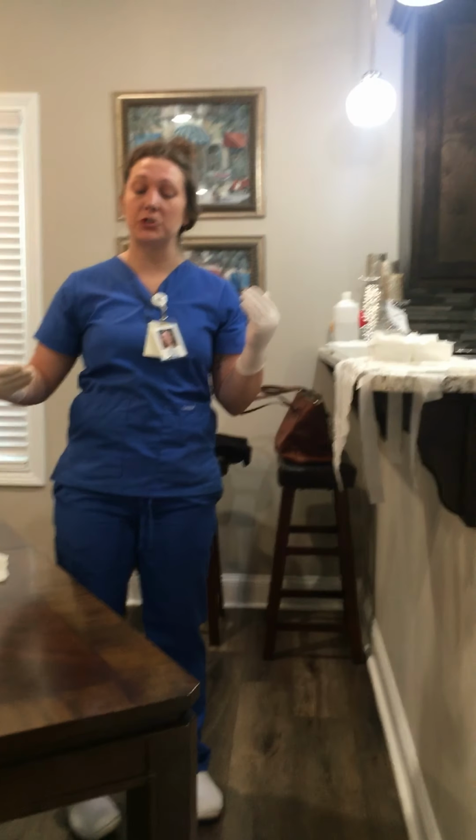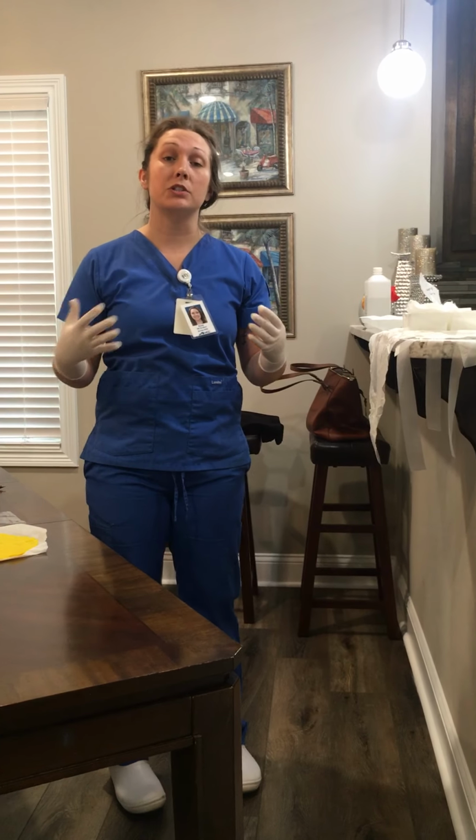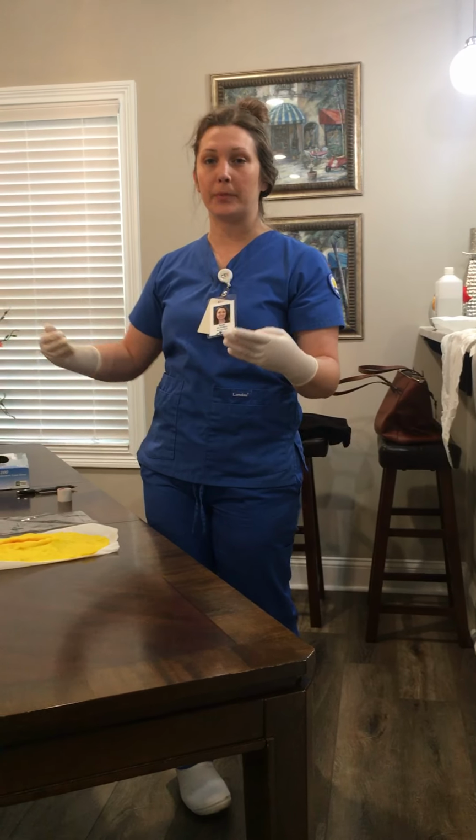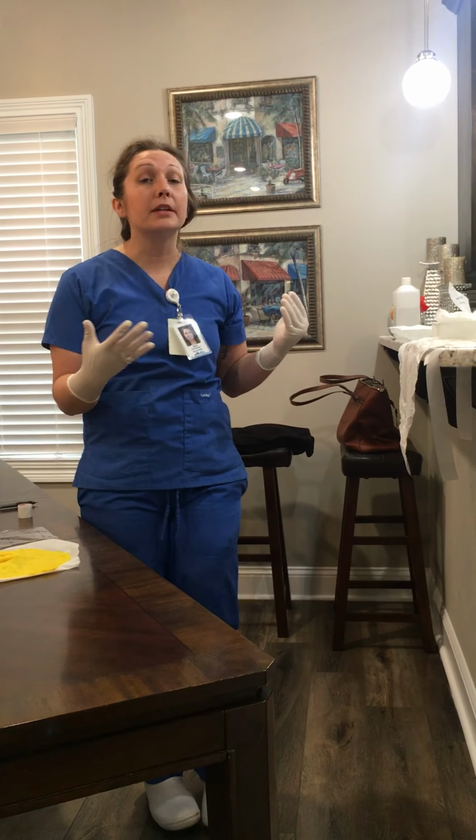Normally, the bed of the patient would be at my waist level, just to ensure that I don't leave my sterile zone. But for this purpose, this table is a little bit lower, but we are going to pretend that it is at my waist level. So now I'm going to cleanse the wound.